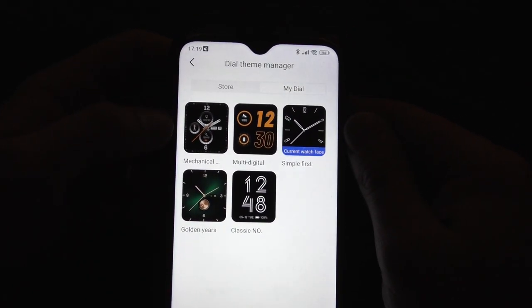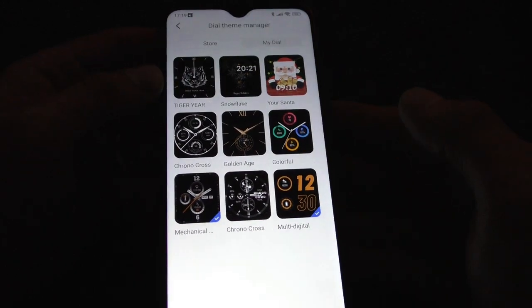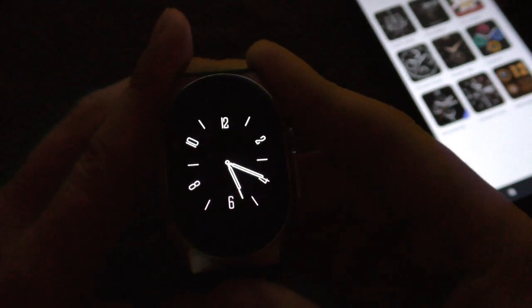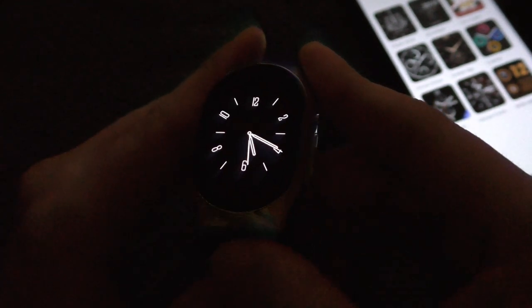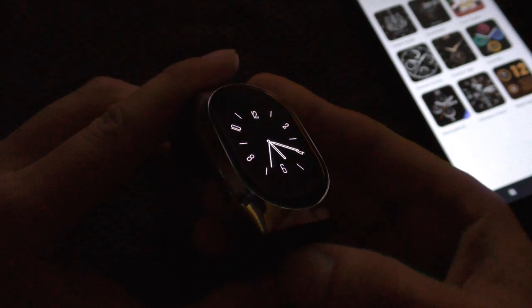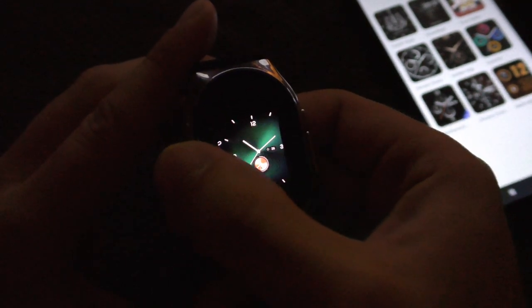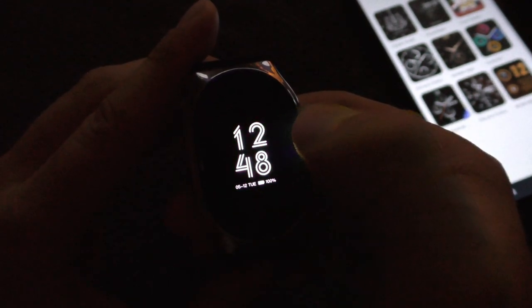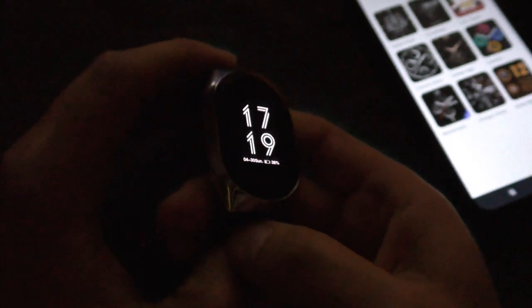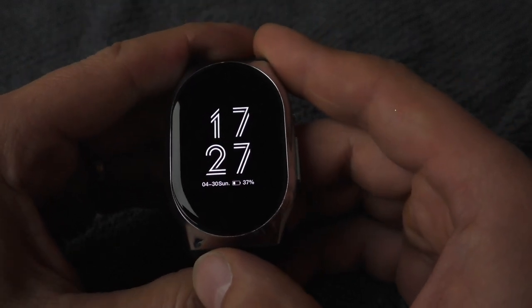Like other smart watches, this one also has different themes to choose from on the app. Let me show you two of my favorites. I like this one because it is simple, clean, and looks very classy and elegant, even though it doesn't show much information. The other one is also clean but does show a little bit of information like battery life and day and date.